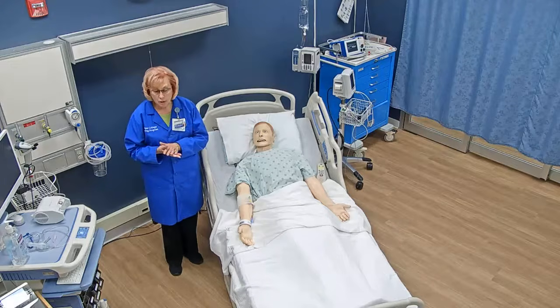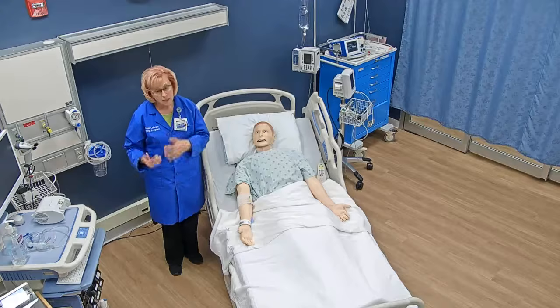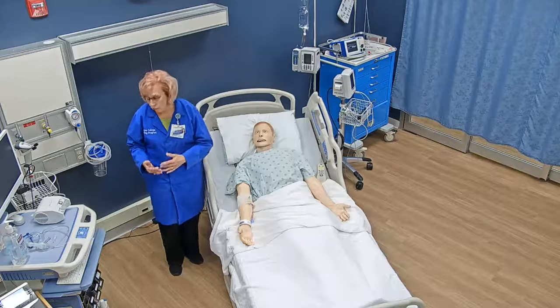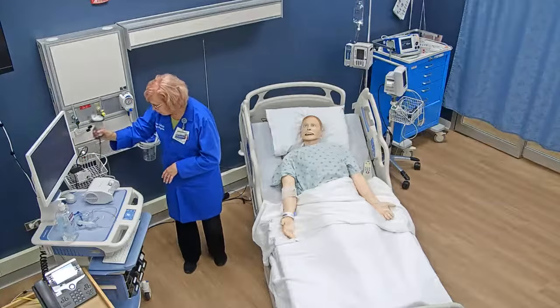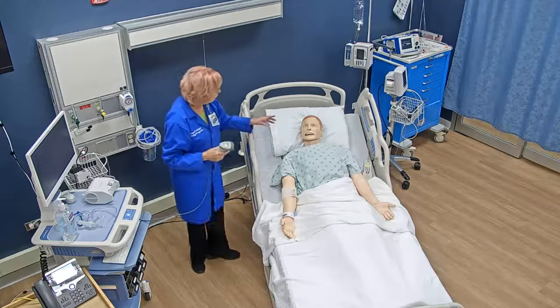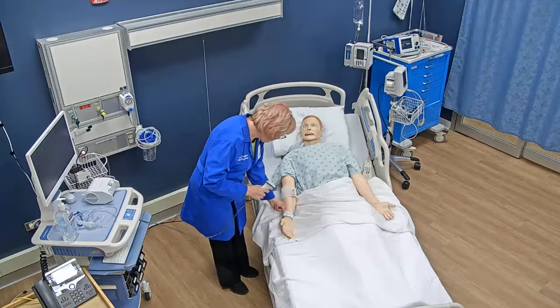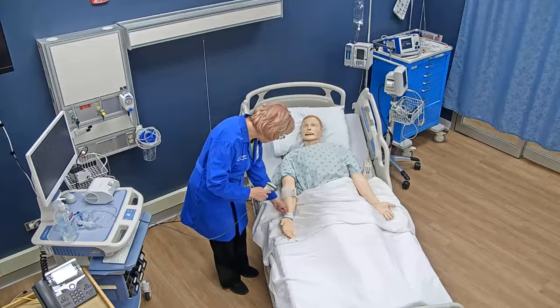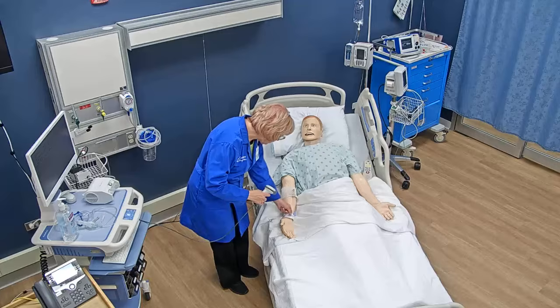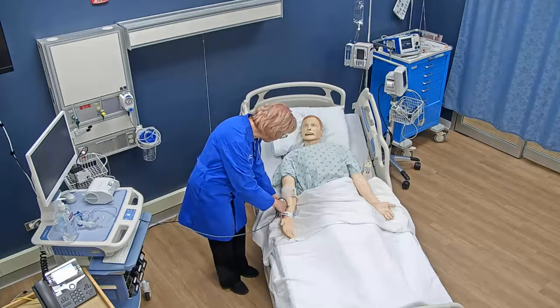So I have already done my first 2 of my medication checks. And now that I'm in the room, I'm going to do my 3rd check. I'm going to start my check by identifying the patient. So I ask him, sir, can you please tell me your name and date of birth? He tells me his name is Williams and his date of birth is 12/12/19XX, which I verify on the name band. I scan the band.